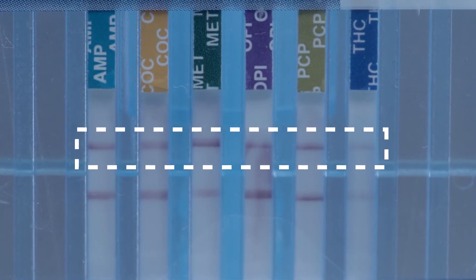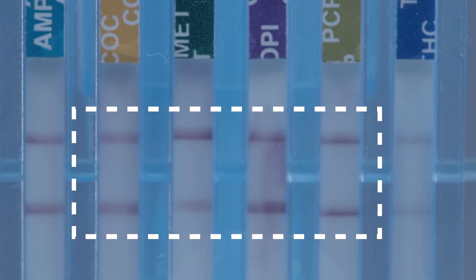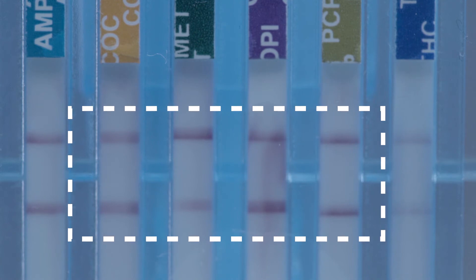Make sure that the top control line is visible for all test strips; otherwise, the test is invalid and the results must not be used. Two lines appearing, as seen in this example, show a negative result.